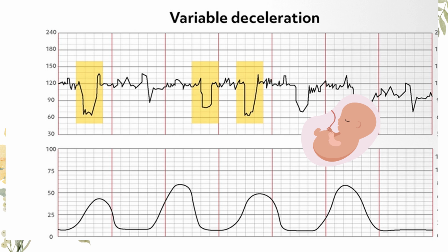Sometimes this might happen after we break a water bag. And we might have to do a procedure called an amnio infusion where we have to hook up an internal uterine pressure catheter device, slide that into the uterus, and hook up some IV fluids to give some extra cushion in the uterus so the baby's not up against the cord. And that's called an amnio infusion.